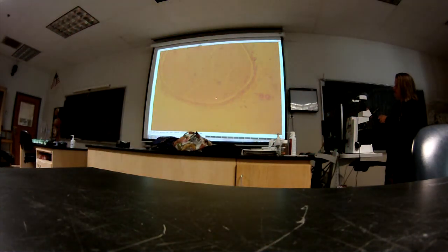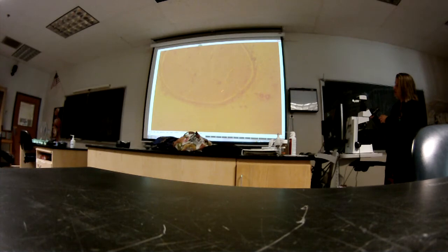Okay, this right here, what is this structure? A fascicle. It's a fascicle. Good, great. Okay, and so what about this? Not that one. How about this layer that's binding them together? Yep, that's the perineurium. Great, perineurium. Okay.